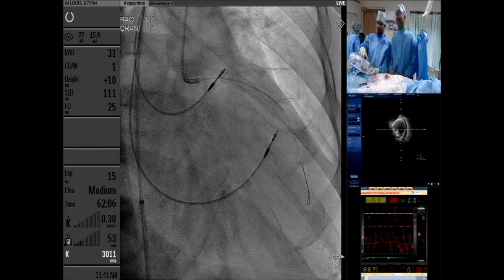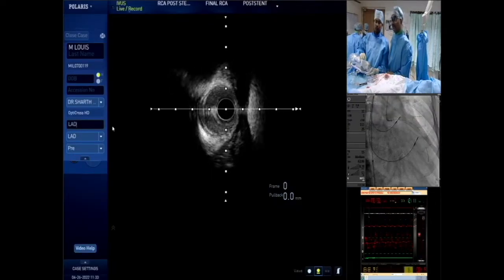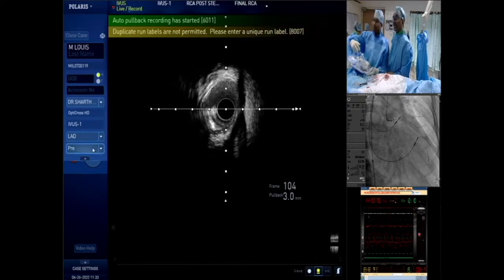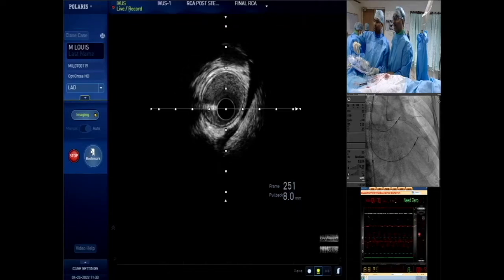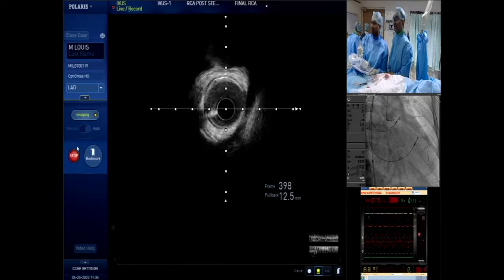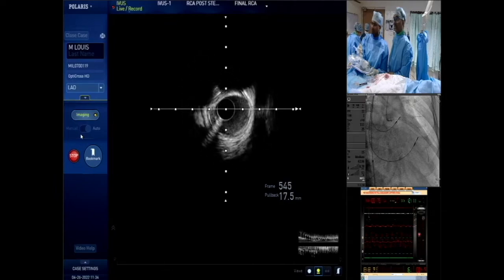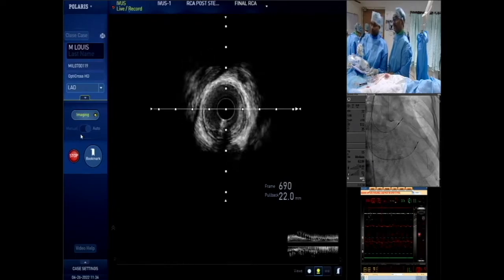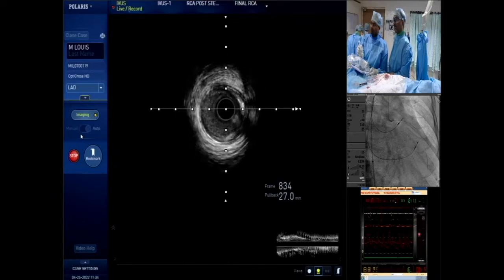It's only the retrograde marker technique. We generally don't cause much damage to antegrade vessels. So the speckling is good. Overall LAD flow is nice. And we can also see the vessel is quite small. Actually, it is looking like a 2.25 vessel. Yeah, there is some plaque here, but it's okay. Not much, probably around 40% or 50% plaque.